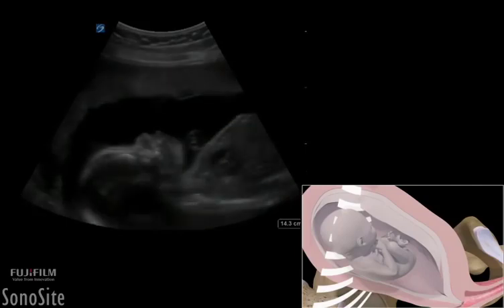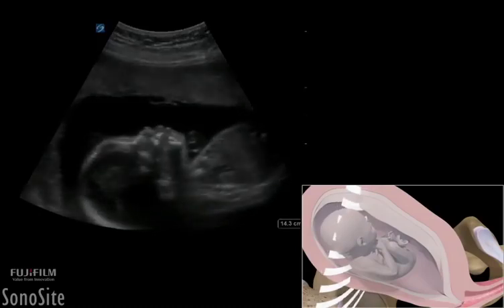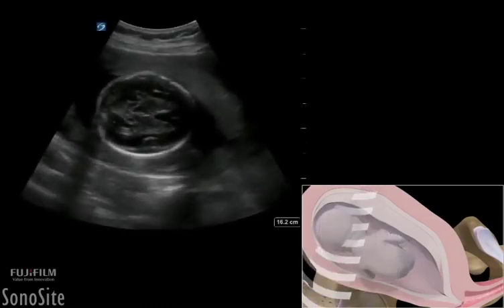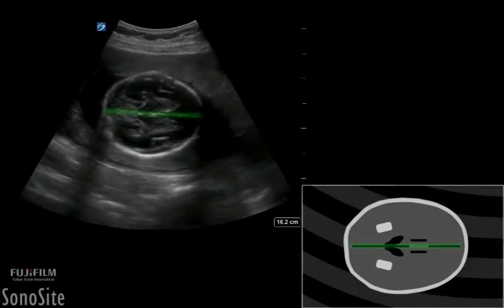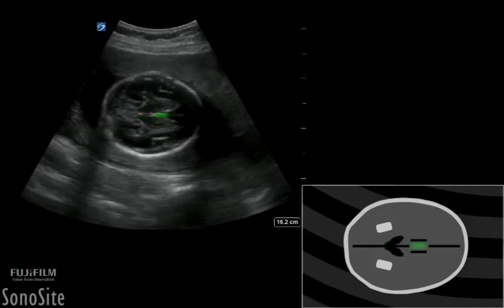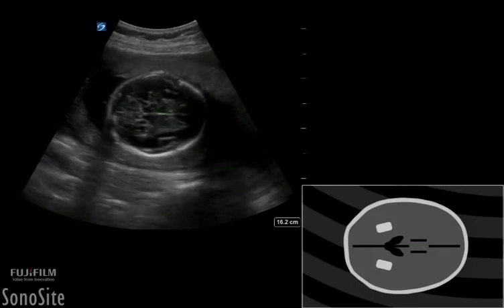A systematic fetal survey is performed to identify the fetal structures. After identifying the fetal head, the transducer is moved to obtain a cross-section of the fetal skull at the level where the falx cerebri is midline. The thalami are symmetrically positioned on either side of the falx, and the cavum septum pellucidum is seen in the distal third of the fronto-occipital diameter, giving an oval, symmetrically positioned skull.